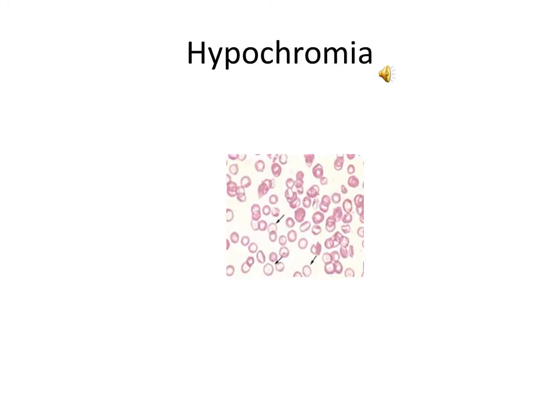The cells you see pointed to in this picture are hypochromic red blood cells. They have a central area of pallor greater than 3 micrometers. We know to look for hypochromic red blood cells when our automated machine readings give us an MCHC less than 32%. However, if you're looking at a peripheral smear, don't be unduly influenced by what the MCHC reading is. If you see hypochromic cells, you should call them that and grade them.